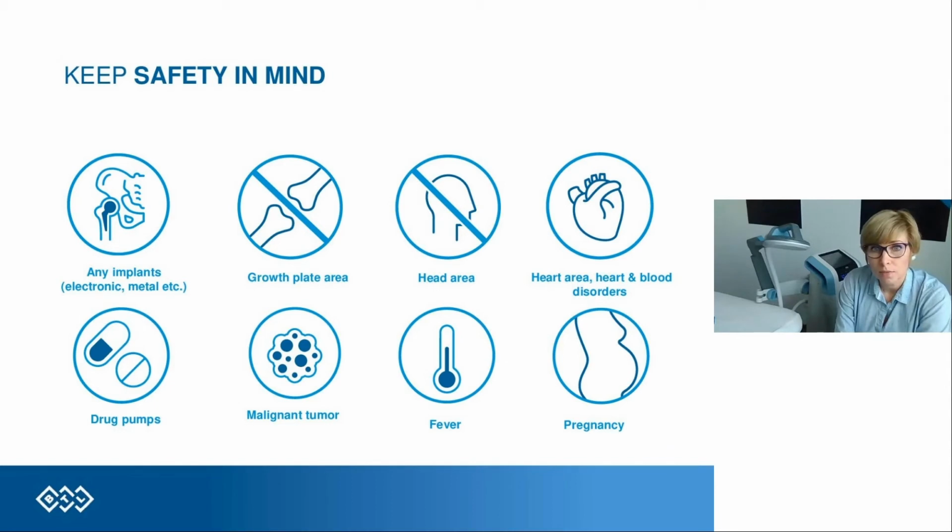Regarding the heart area and thoracic spine and neck, you might ask about them. Of course, we can apply this device and this modality on the neck and on the thoracic area, but we have to be careful with the intensities, because the patient will tell us that he doesn't feel very comfortable if the intensity is too high.